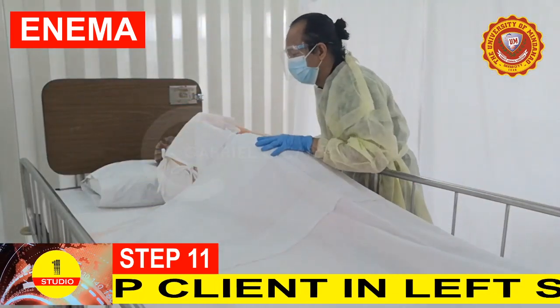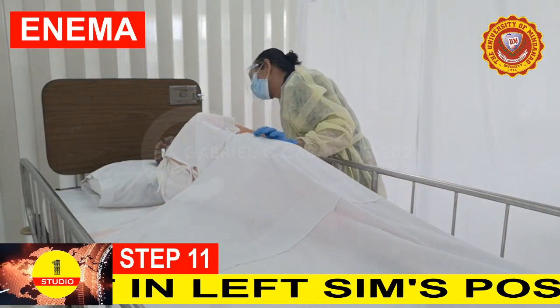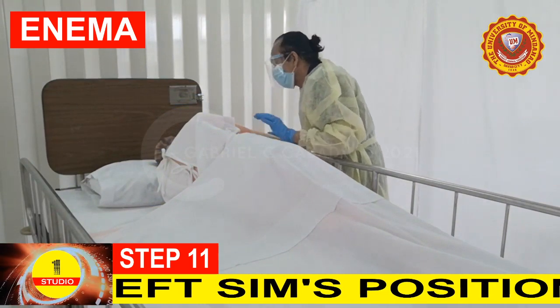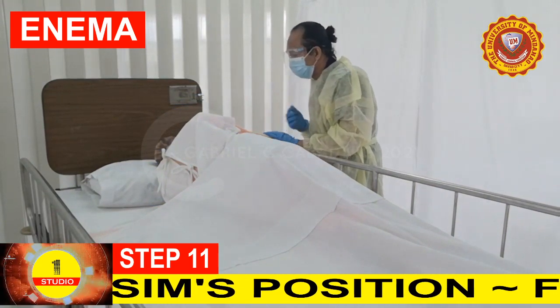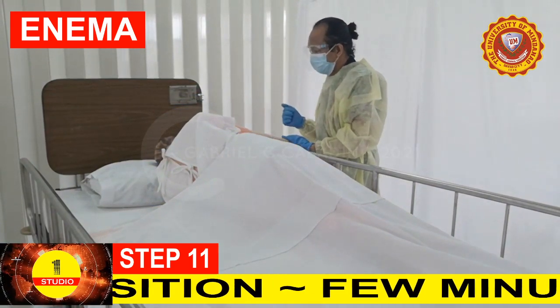Step 11. Keep the client in left Sims position for a few minutes until the client feels the urge to defecate.